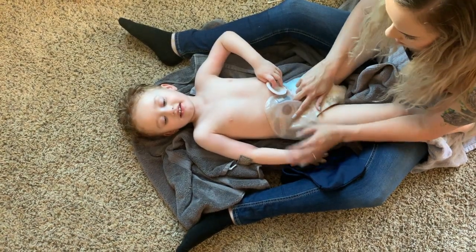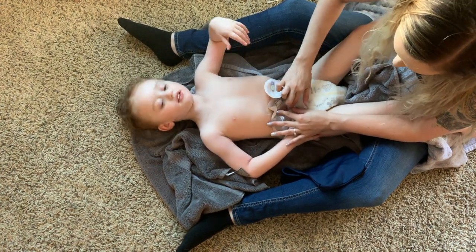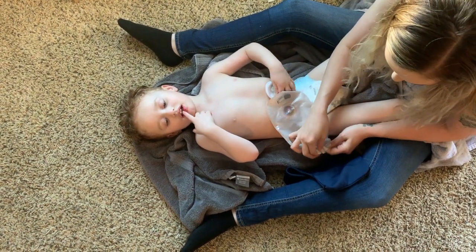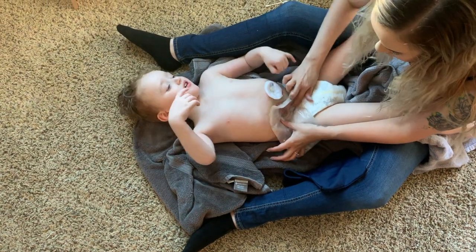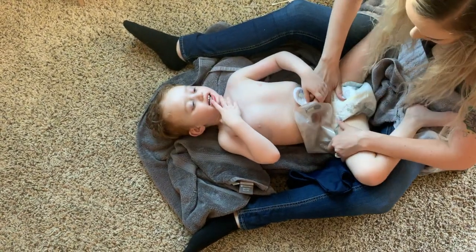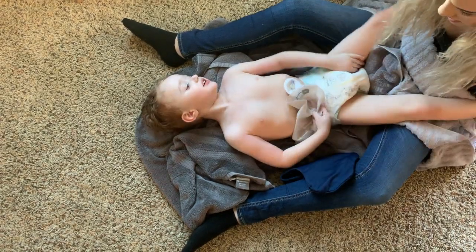Just like the ostomy bag, if any of that stuff gets on his skin, it's really hard on their skin, and it makes a rash really quickly because of how acidy everything in your stomach is. So you just want to make sure that you get a good seal. I always push down and make sure that I have a good seal, because if you don't get a good seal the first time, it will come literally right off within just a few hours. So I just make sure I have a good seal on it.